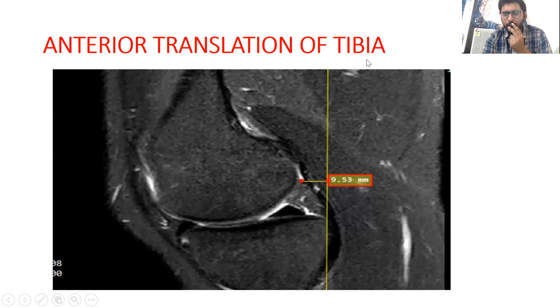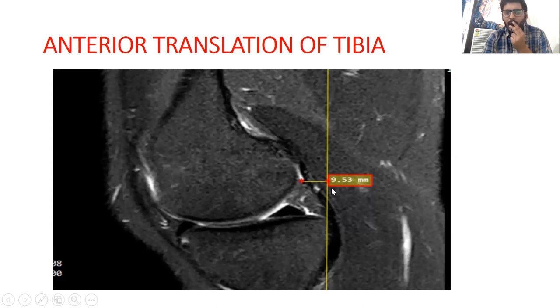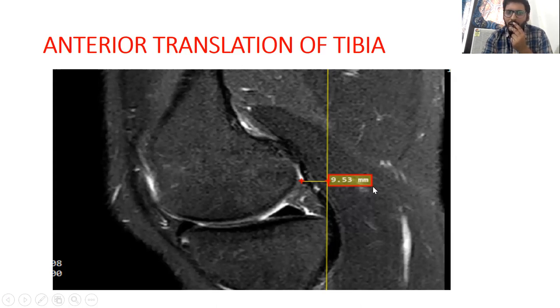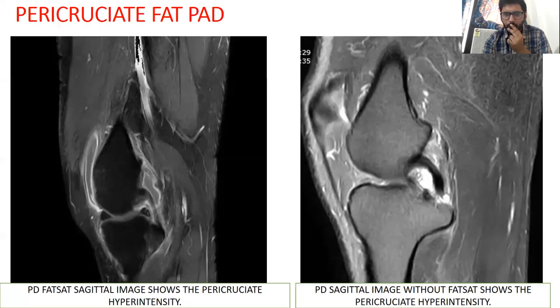Anterior translation of the tibia is the radiological analogue of the anterior drawer sign. A line is drawn along the most posterior part of the tibia and the most posterior part of the femur. If the distance between these two lines is more than 5mm, the anterior translation of tibia test is said to be positive — as in this case, where it is 9.5mm.